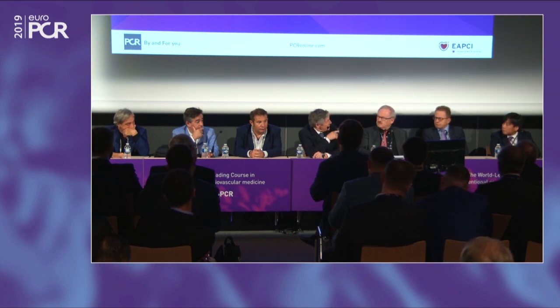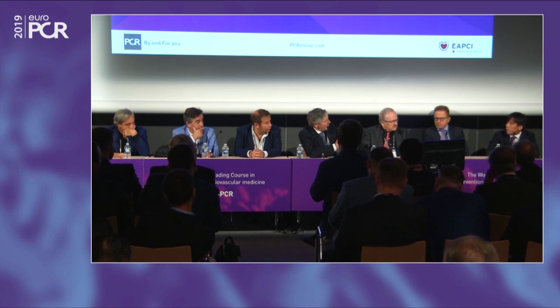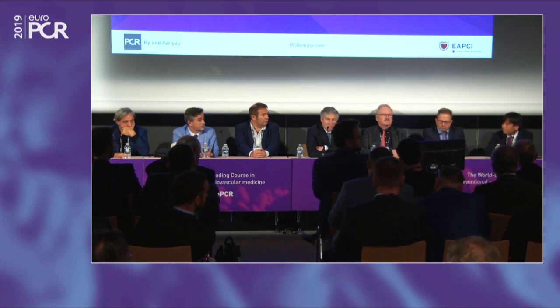So do you plan to do that on the follow-up? We will work on that. Because I think it will be very interesting to see that we have continuing movement of the two branches of the bifurcation. Yes, so in this study, we have an academic team to work on all the angiography, and all the cases were screened by the dedicated bifurcation software. But as one of the sub-studies, we try to do this three-dimensional QCA, systolic, diastolic, to see this effect.